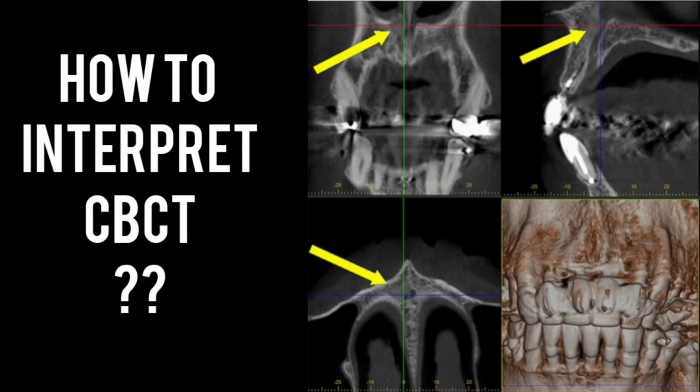Most CBCT units have a small footprint enabling office placement. Patient's head must be immobilized to get a good final image. Then the end result is 3D visualization of oral and maxillofacial complex from any plane.